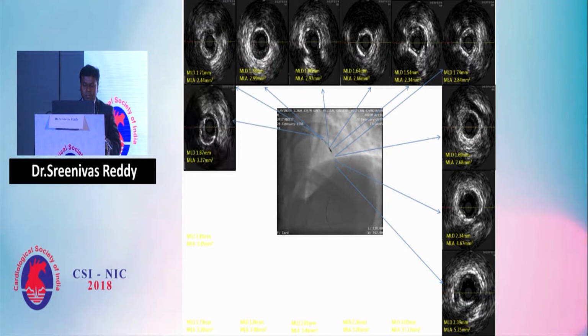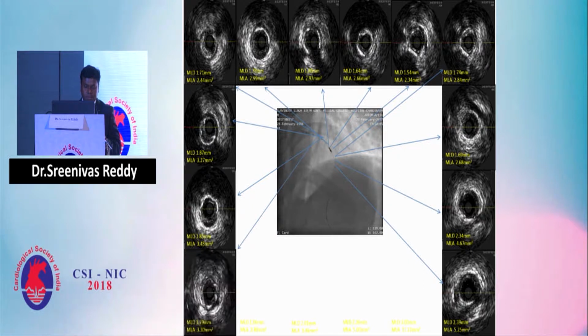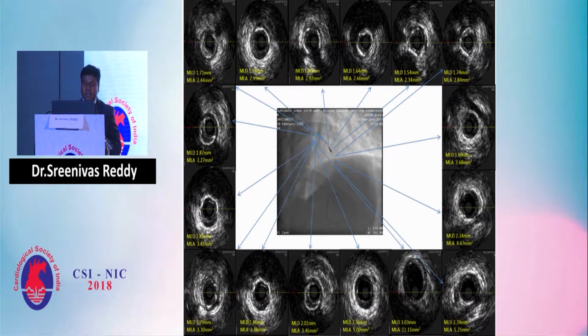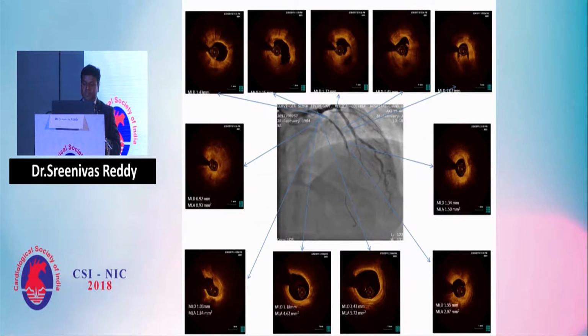If we come further in the proximal LAD, there is a plaque here, a echolucent region, and there are a few calcifications. So probably there is no clear rupture evident in this plaque. This is like a moon shape. This is the soft plaque. Coming closer, the disease is extending up to the ostial LAD. So again, just compare both the imaging sides, the same slice set.